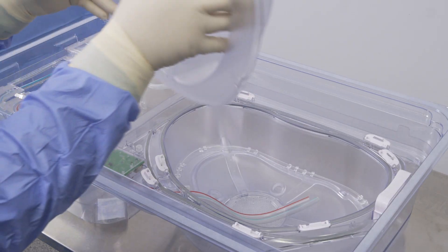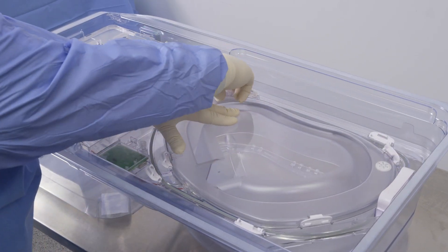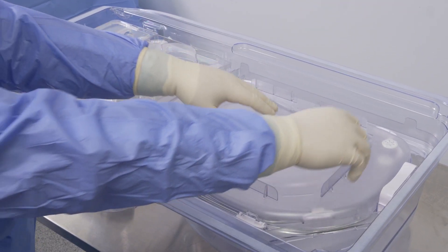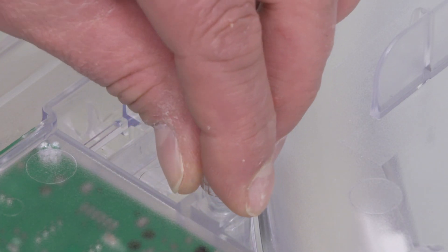Using standard aseptic technique, replace and secure the inner perfusion circuit lid followed by the outer perfusion circuit lid. Place the lure lock cap on the oxygen port.